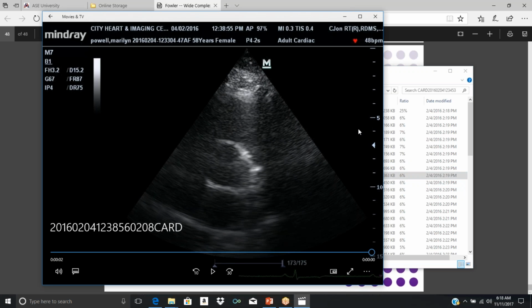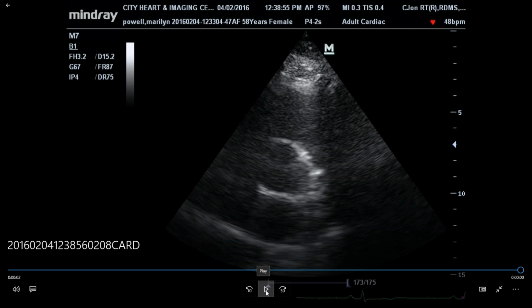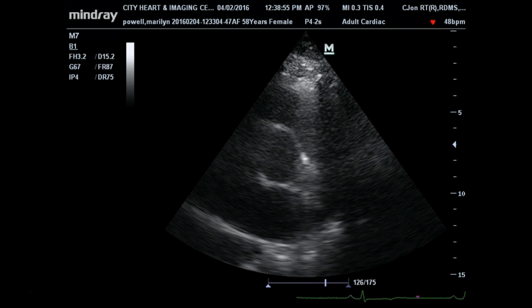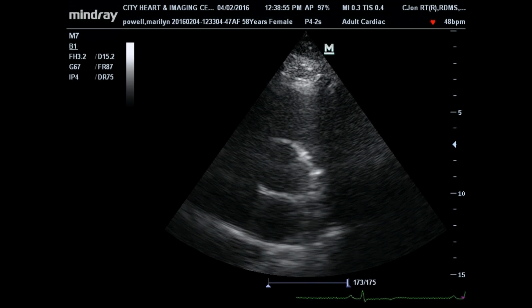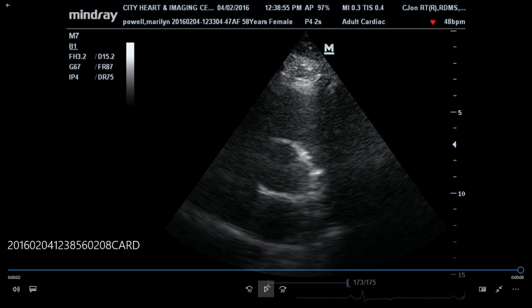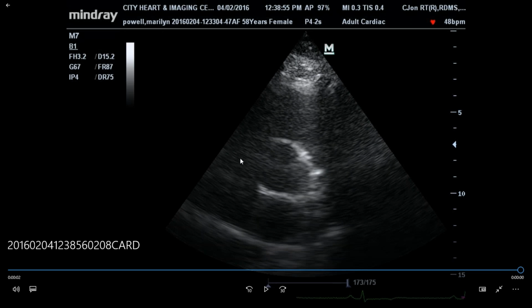So, because you have to record the study, what I recommend that you do is you can play around until you get a good image, but only record the good image, all right? Or the best image then, because sometimes it's not. So we don't want to see everything. The person who is reading the study doesn't want to see everything. So you can play around. When you get your good image, then you record that. So it says your aorta with the aortic valve inside, pulmonary valve is over there, tricuspid valve is right there.